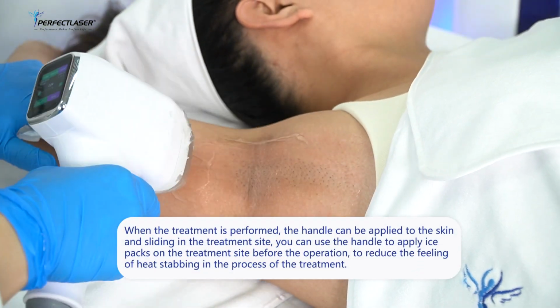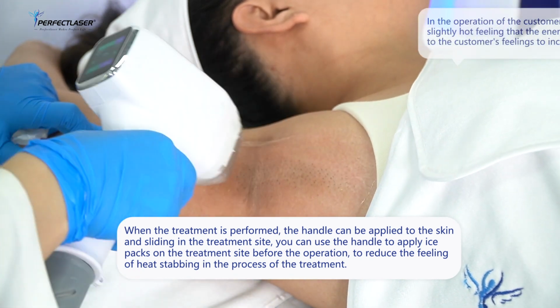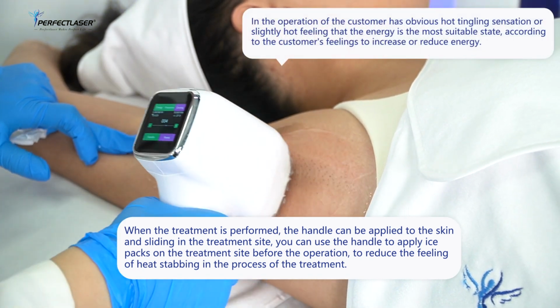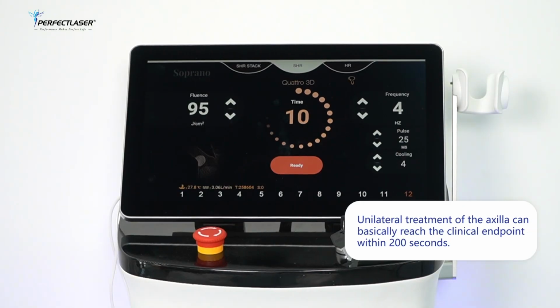Press the handle button and slide it against the client's skin vertically. Ask the customer whether there is a sense of warmth. If not, you can increase the energy or pulse width. At the same time, use the cooling on the handle to apply ice to the customer first for better comfort.